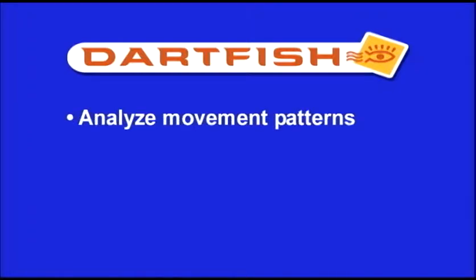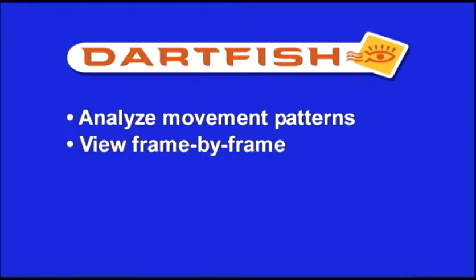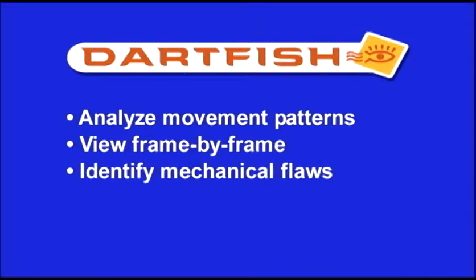This unique system allows for clinicians at JOI to analyze movement patterns performed in just about any sporting activity. By viewing high-speed movements at slower frame-by-frame speeds, we are able to see abnormal movements and mechanics that may be missed by the naked eye. It allows our clinicians to identify mechanical flaws that may result in injury or impede you from optimal sports performance.